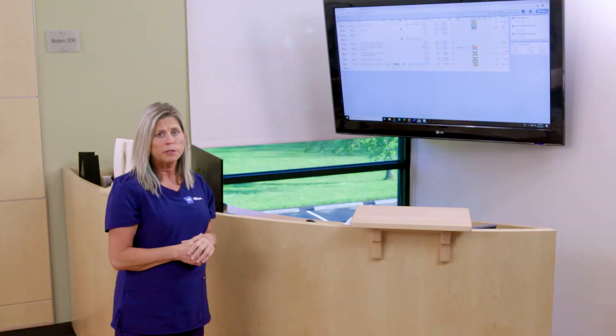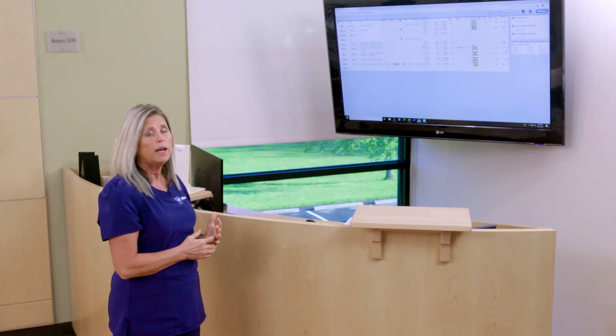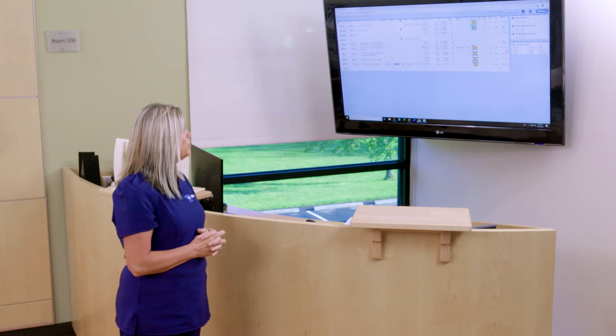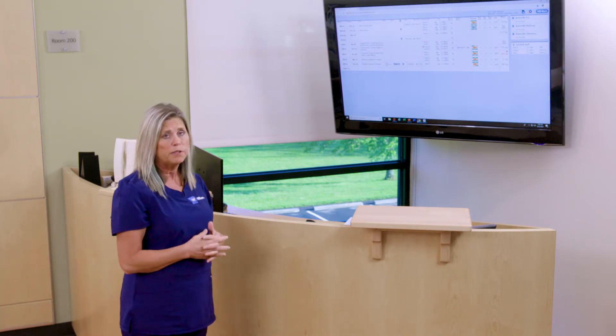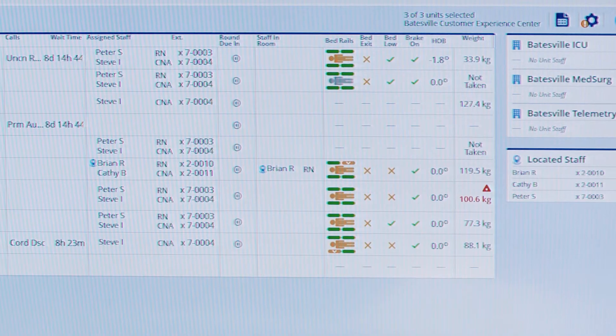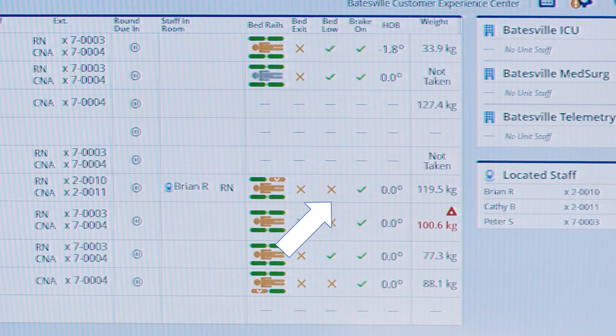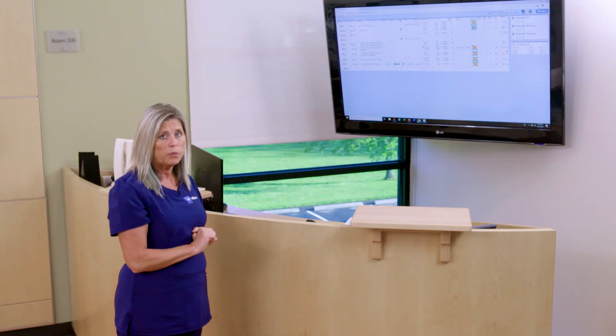Next we're going to talk about bed data. When you have a Hill-Rom smart bed, you're going to have visibility to many factors around patient safety.